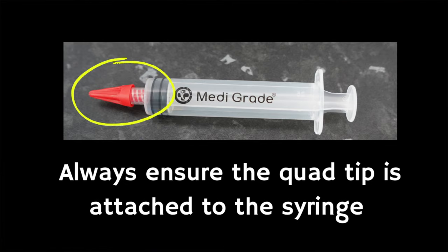It is normal to feel pressure but this should not be painful. If it is, stop using the equipment. If any pain is felt, stop and speak to your doctor. You should also never irrigate the ear with just the syringe — make sure that you always have one of the quad tips added. Once you've completed the first round of washout, tilt your head to one side to allow any excess water to drain. You can repeat this if necessary.